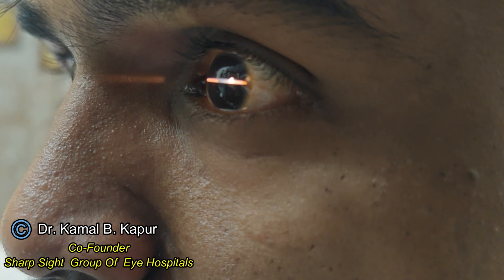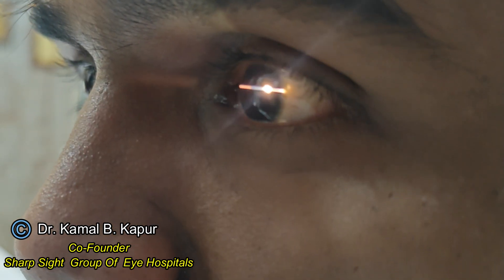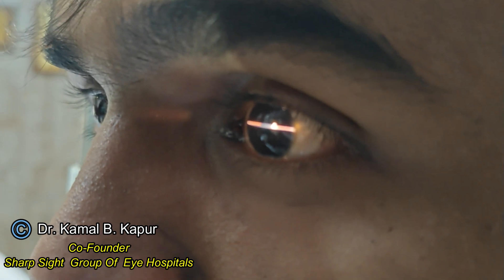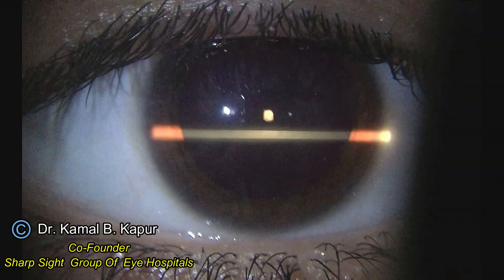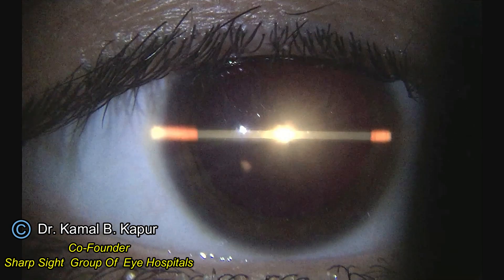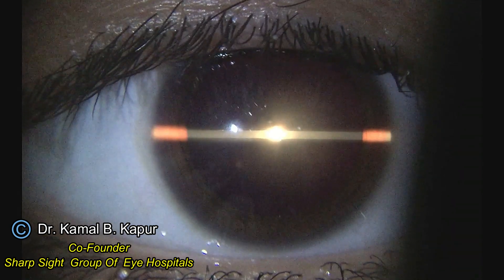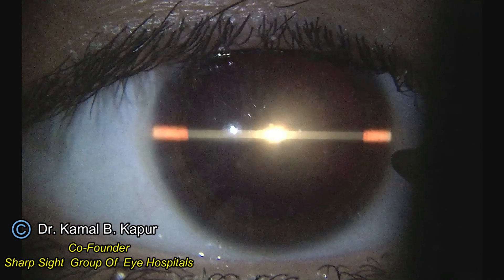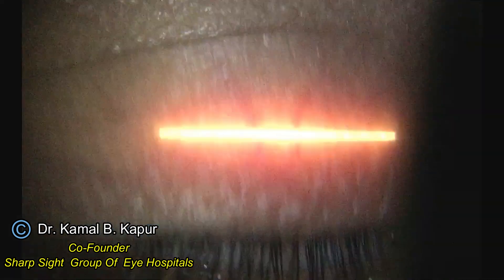We ask the patient to place his head straight while touching the forehead in the center, then focus the slit beam onto the cornea and ask the patient to look into the light. This gives us a central Purkinje reflex. All we need to do is align three points — the thinnest slit possible and the Purkinje reflex in the center — and then we can mark the two points of the limbus, which gives us the axis of 0-180.